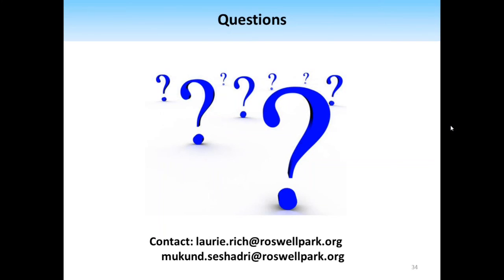What is going on in the tumor when you're imaging with photoacoustic imaging could be different than what's going on with your BOLD or oxygen-enhanced MRI. In terms of the radiation, again, it's a good question, because we actually performed imaging 24 hours before we gave the radiation. So it is possible that there were changes, and one of the things that might be interesting to do is image immediately before.